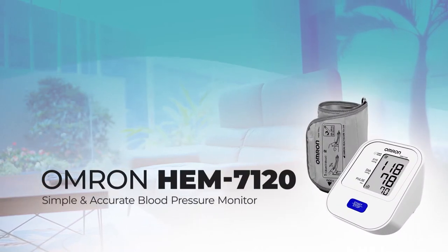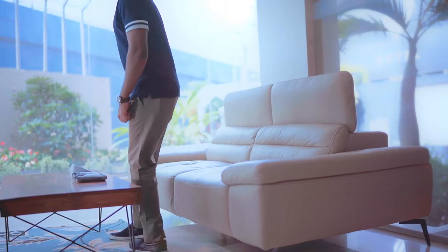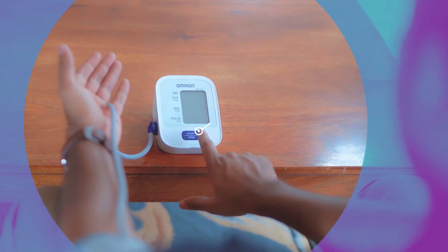The Omron HEM7120 blood pressure monitor gives you accurate readings in just a few minutes. Simply connect the cuff to the side of the device, then press the start-stop button.